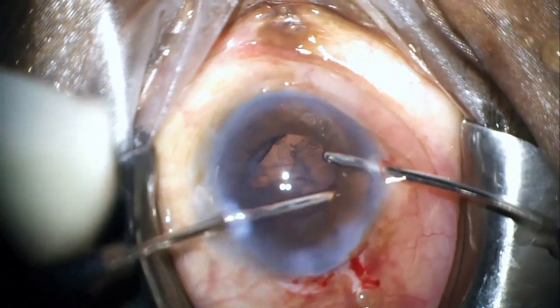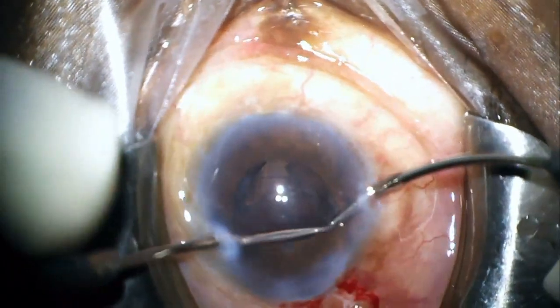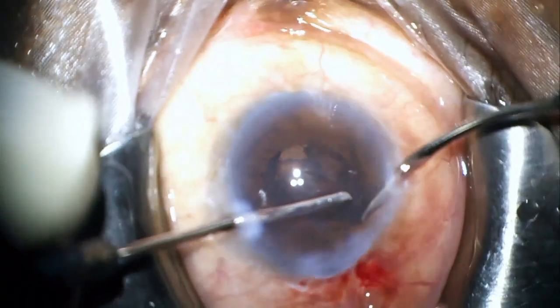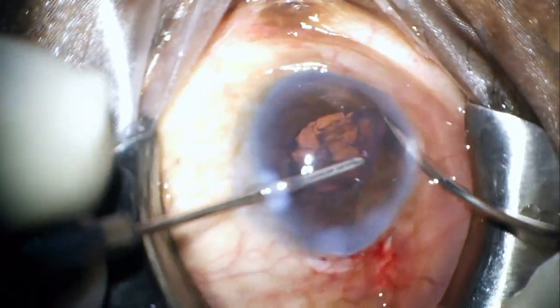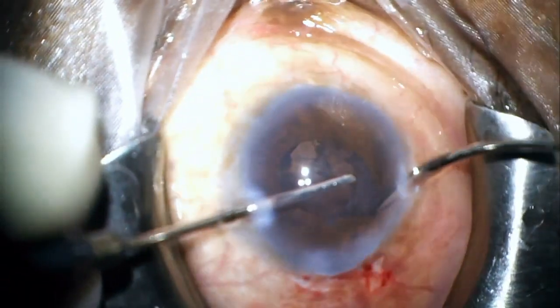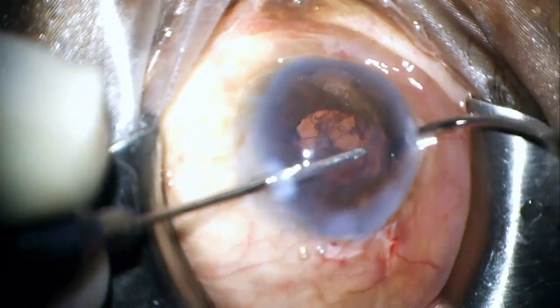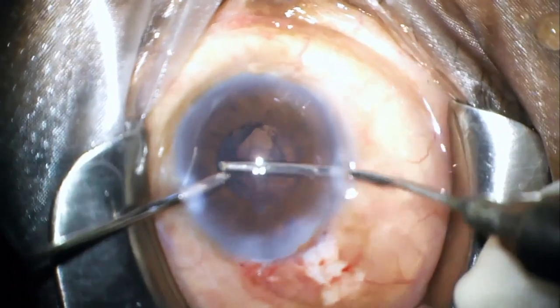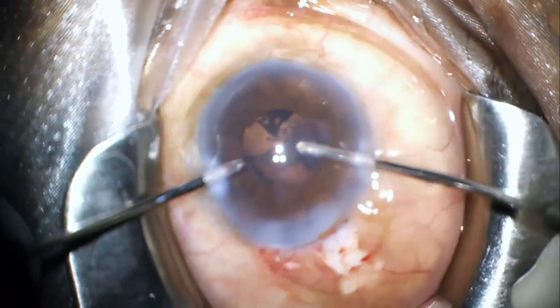Next I thought maybe I should use bimanual irrigation aspiration probes, which may be better and less traumatic for retraction of the iris, and also the flow from the irrigation cannula may probably help to mobilize the fragment better. However, to my despair, this maneuver also didn't help.